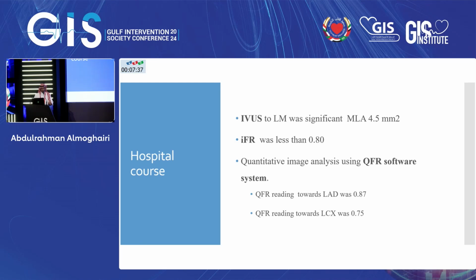And then we enforce the new modalities, since imaging is now encouraged by the guidelines for the diagnosis and to support the intervention.